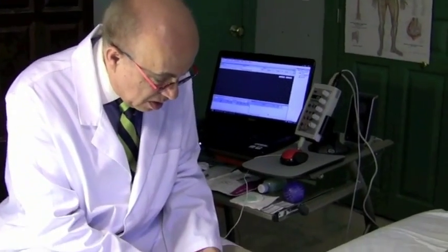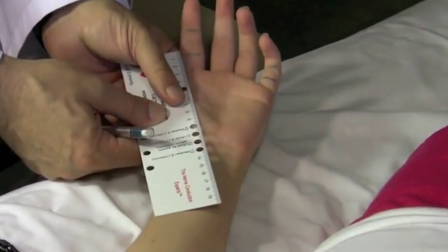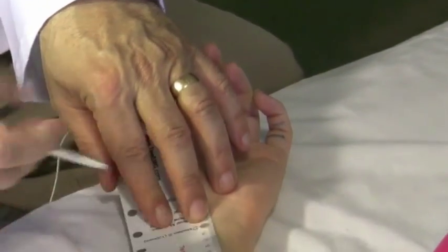So I'm going to put the 0 here. It's in centimeters, of course. And I'm going to see that the 13 centimeter point is here. So basically what I'm going to do is mark up the spot here.